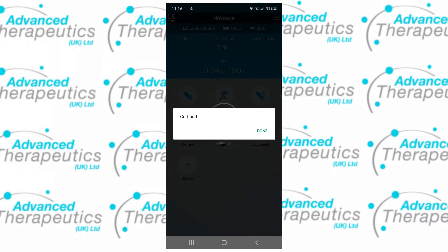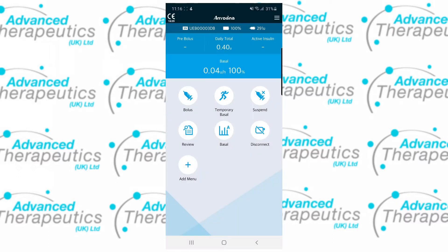The app home screen gives you access to lots of interesting information, including the serial number of the pump that you're connected to, the daily total of insulin so far, your pump battery, your pump insulin indication, the last bolus delivered, as well as any active insulin you may have on board.